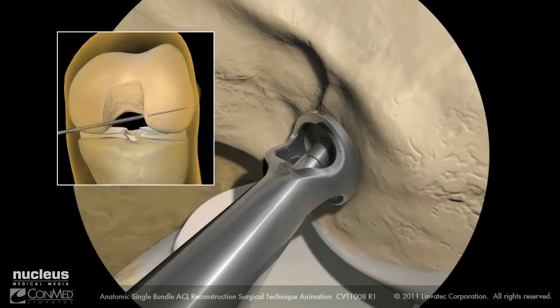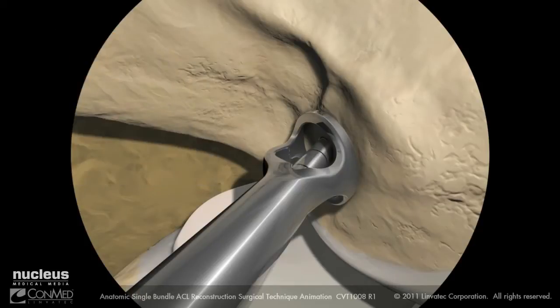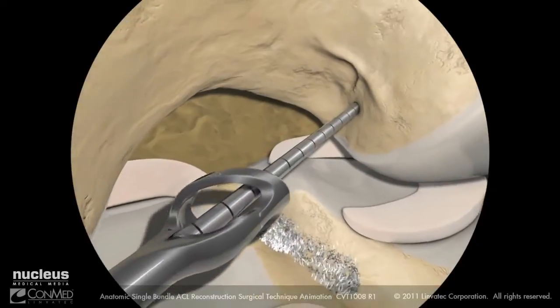Continue advancing the guide pin out through the skin laterally, using a twisting motion to remove the femoral footprint guide.